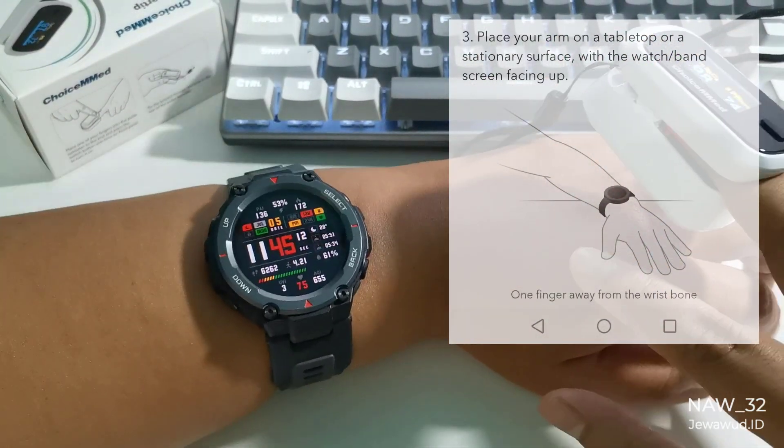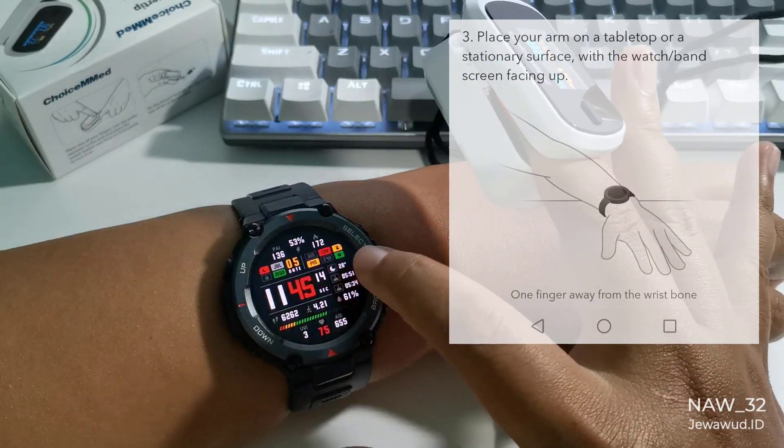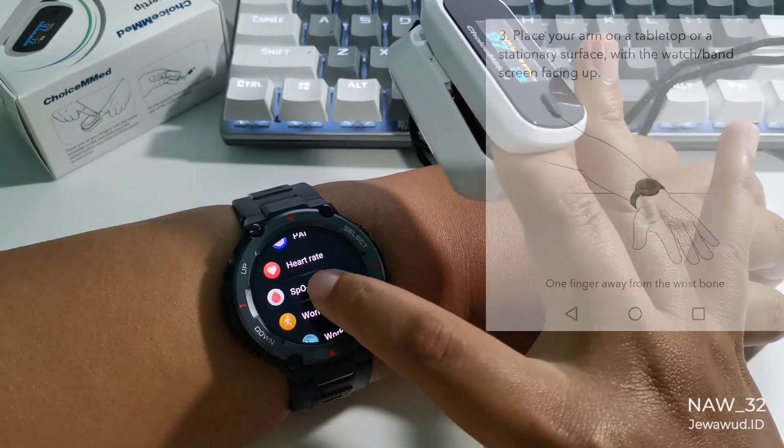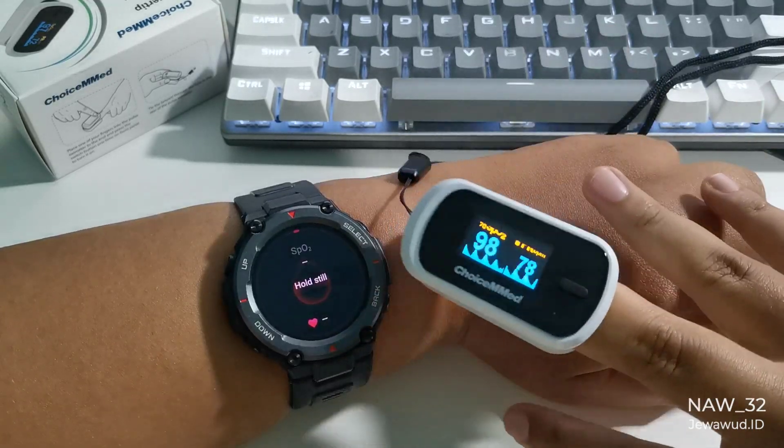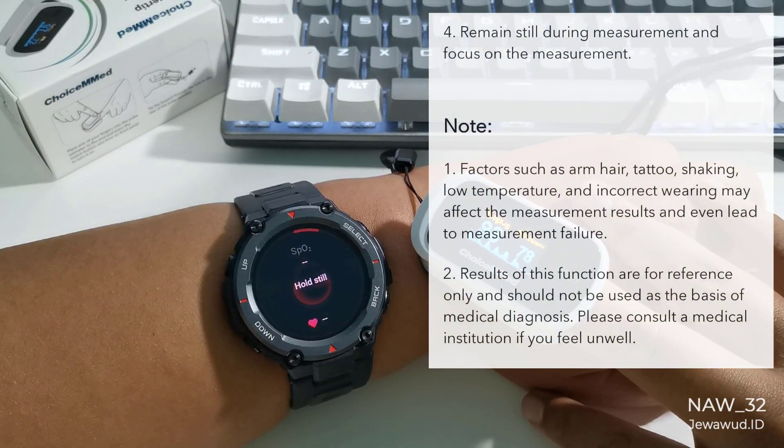First, the oxygen saturation test. In this SpO2 measuring test, I will do the test three times and compare the results between the Amazfit T-Rex Pro and the oximeter. And also I will do an SpO2 test while holding my breath.